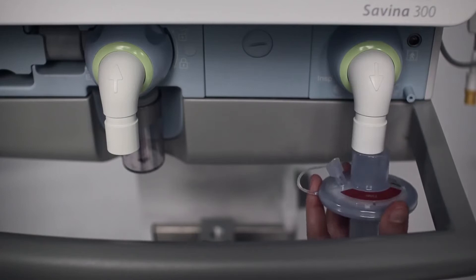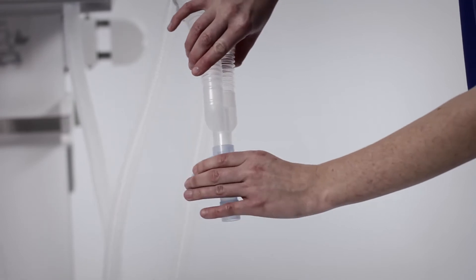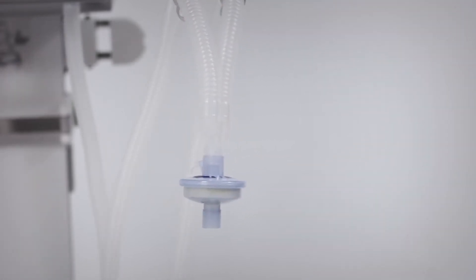If no breathing gas humidifier is used, we recommend the use of an inspiratory bacterial filter, which has to be fitted onto the inspiratory port, or an HME which you can put onto the Y-piece.